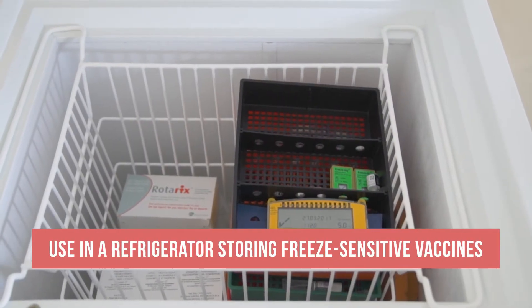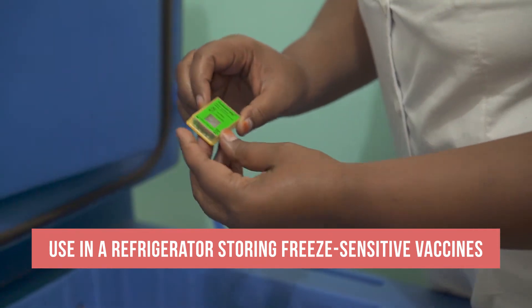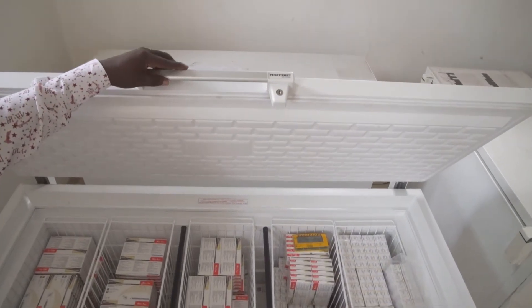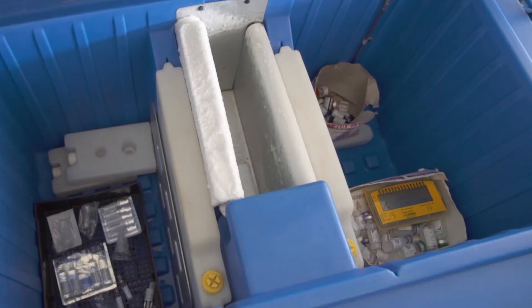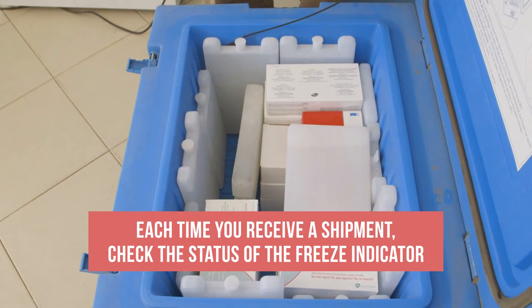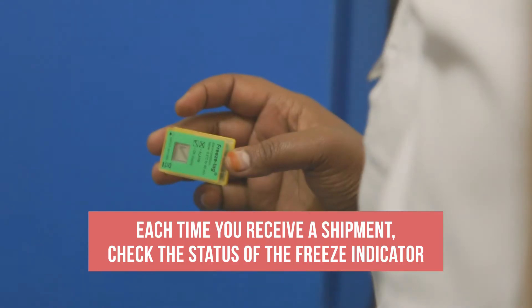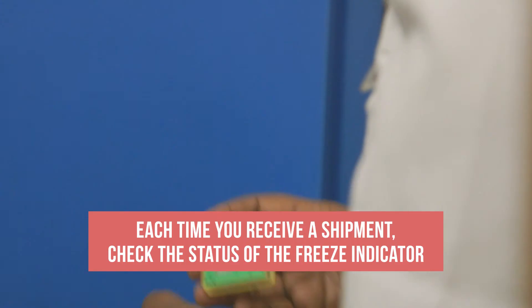They may also be used in a refrigerator storing freeze-sensitive vaccines. They should be placed on top of the vaccines where they can be easily read. They are not needed in refrigerators where a 30 DTR is used, since this device detects freezing temperatures. Each time you receive a shipment, you should find an electronic freeze indicator in every container holding freeze-sensitive vaccines. Remember to check the status of each freeze indicator as soon as a shipment arrives.